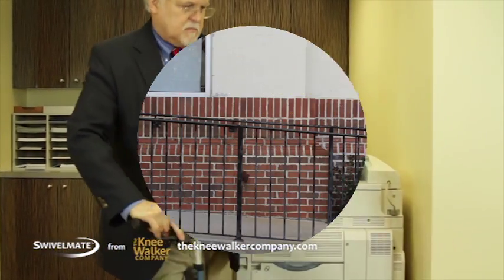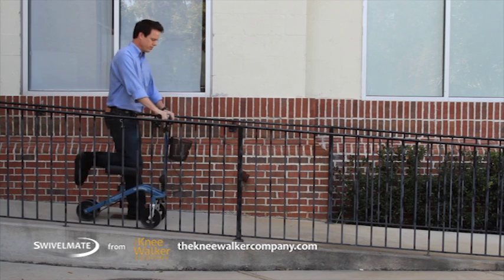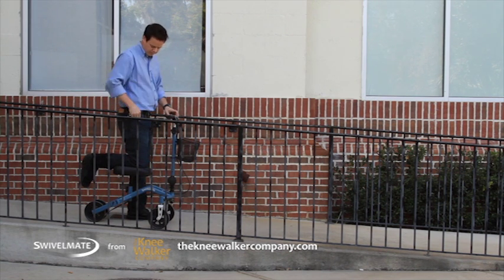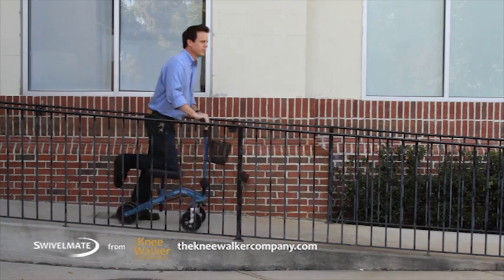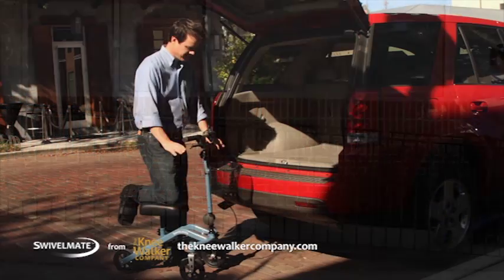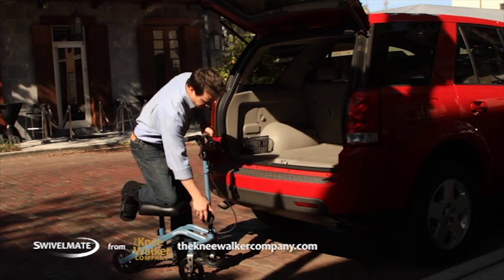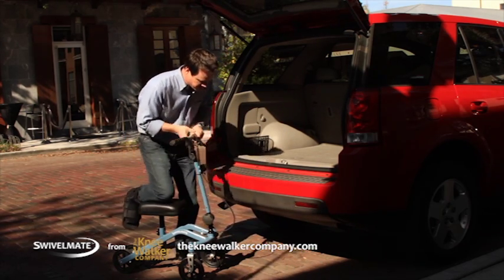And when it's time to pack up, Swivelmate travels where you do. It easily fits in a car — just fold and place it in a back seat or standard-sized trunk and take it anywhere you want to go, even outdoors.